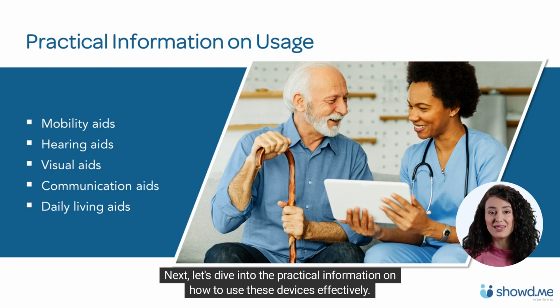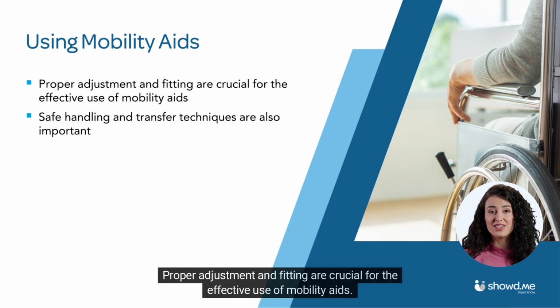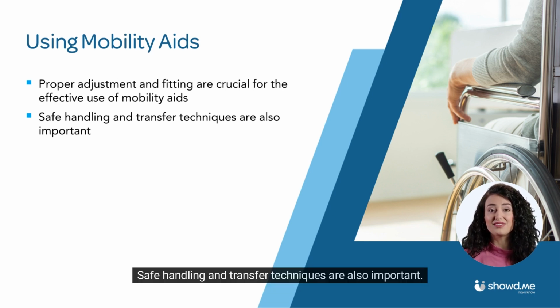Let's dive into the practical information on how to use these devices effectively. Proper adjustment and fitting are crucial for the effective use of mobility aids. Wheelchairs, walkers, and canes should be adjusted to fit the user's height and weight. Safe handling and transfer techniques are also important.